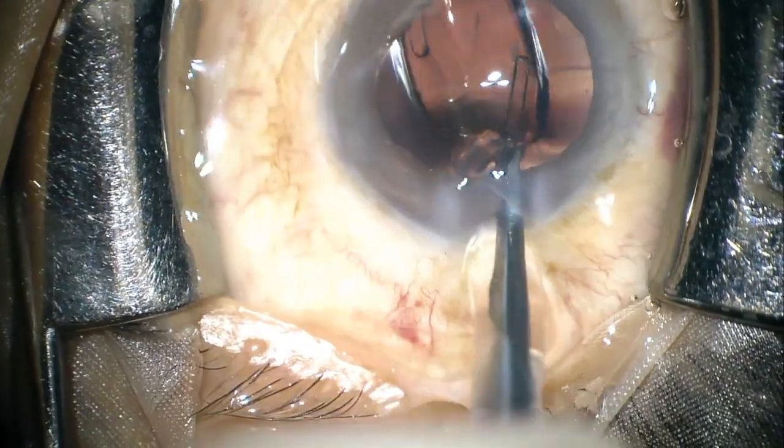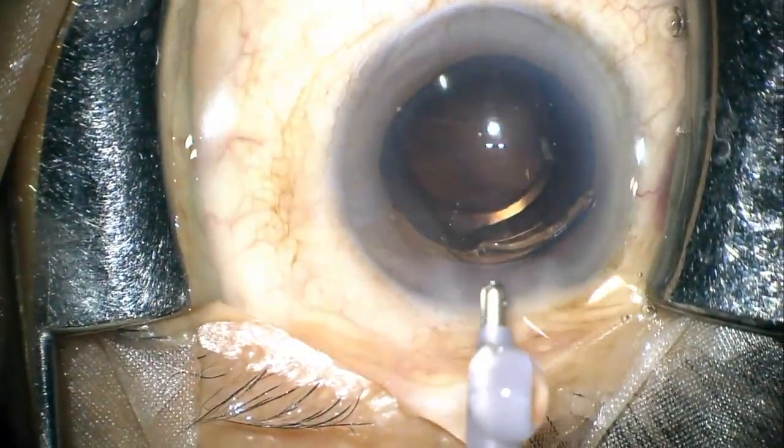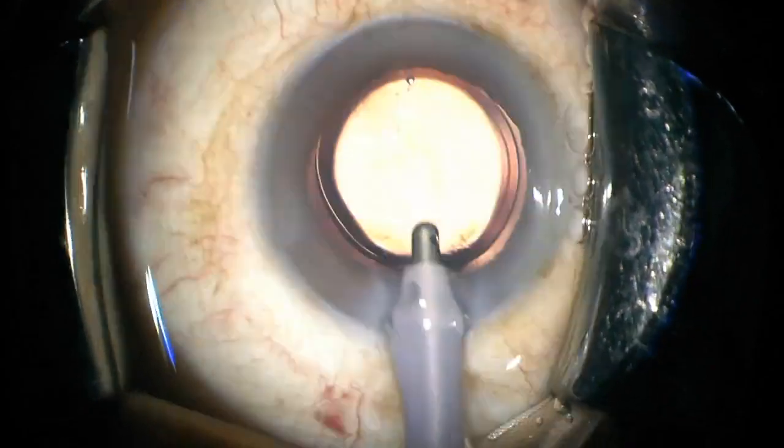This is a regular case with a well-dilating pupil, just to demonstrate how the mark appears to the surgeon and how well the central and peripheral marks are aligned.